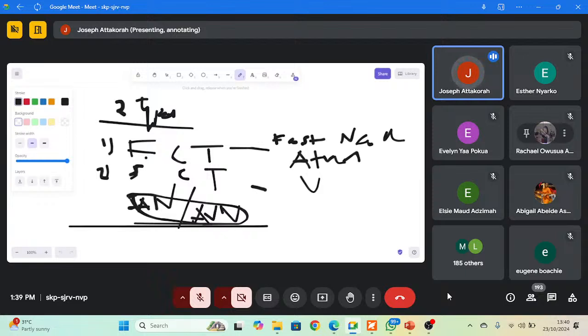The rate, the source, and the pattern. The pattern will tell us the source, and the pattern will tell us the rate. So that is that. What did we learn under the pattern?